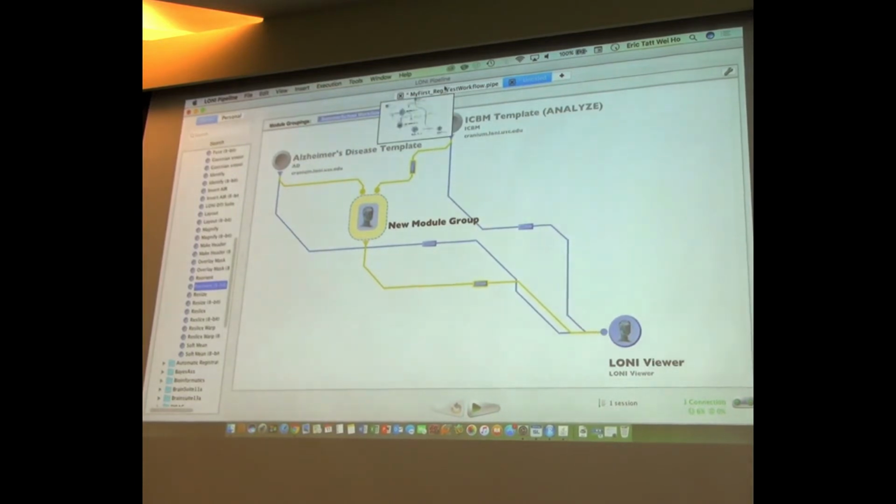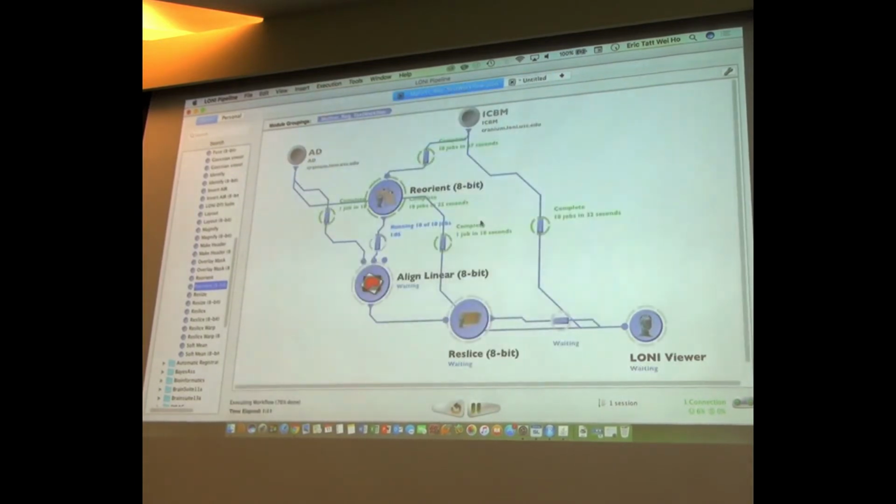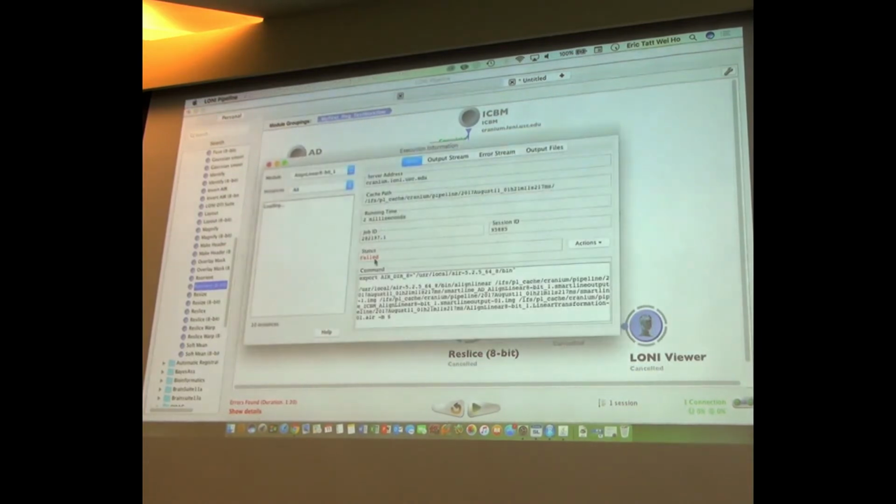Let's see what's happening with this workflow. Okay, well this one is successfully moving forward. So we cracked that problem of long file names. We cracked another problem of the intensities being odd. So this is down into, well, I don't know if we cracked the problem. Let's see. Oh my gosh, this didn't work again. 10 jobs failed. What's the reason now?